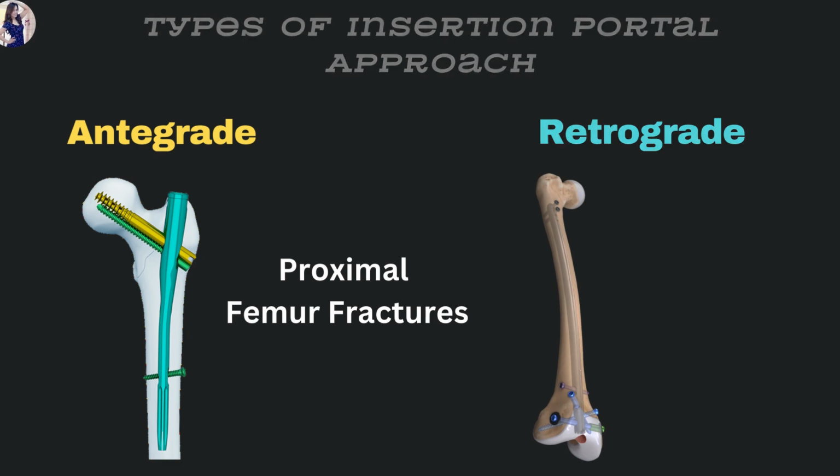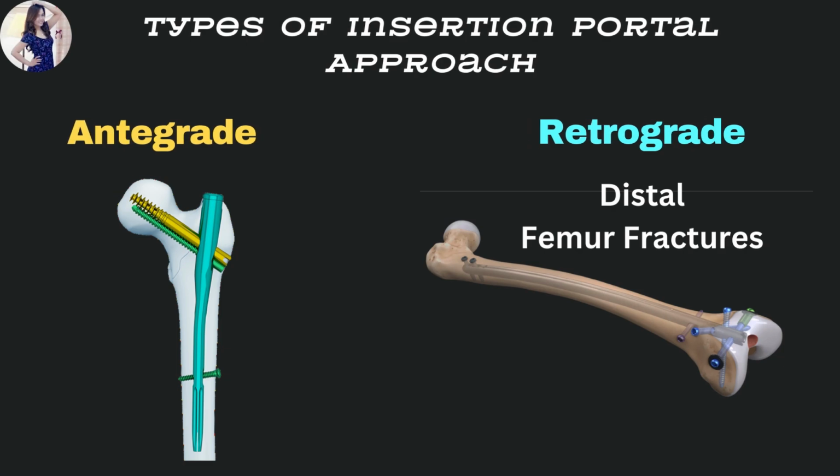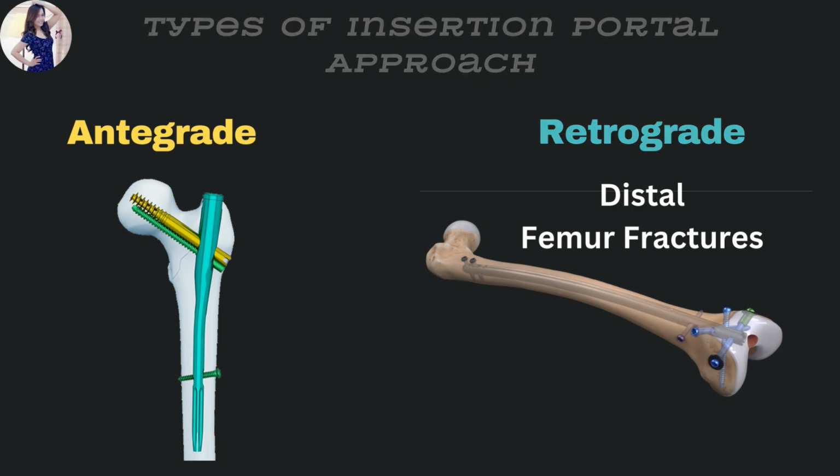The retrograde femoral nailing is intended for use in intramedullary fixation of fractures of the femur to include the following: supracondylar fractures, including those with severe comminution and intra-articular extension, open and closed distal femoral fractures, pseudoarthrosis in correction of osteotomy, pathologic fractures or impending pathologic fractures and tumor resection, bone lengthening, fractures distal to a total hip prosthesis, non-unions and malunions, and fractures resulting from osteoporosis.